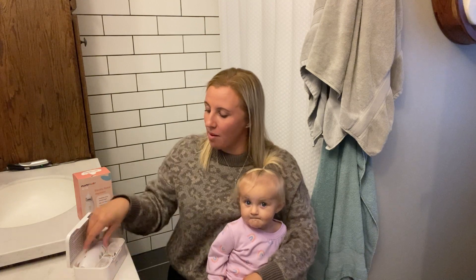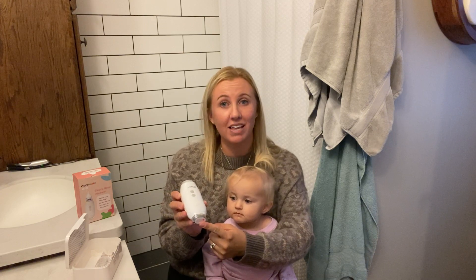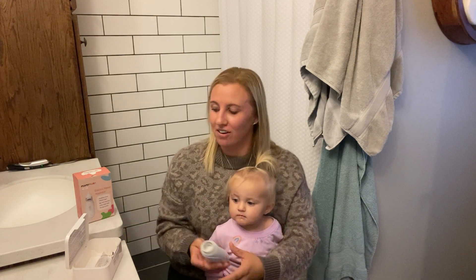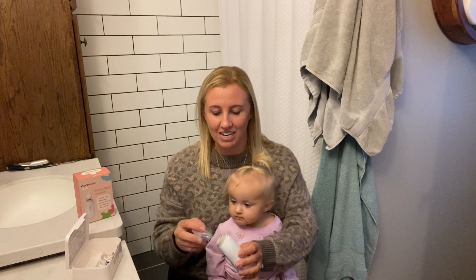Let's open it up here and see what's inside. So we have the instructions right on top. This itself is the actual nasal aspirator and it has a little chamber down here that catches all the snot out of booger noses, because it is cold season right now, so this is going to come in really handy.